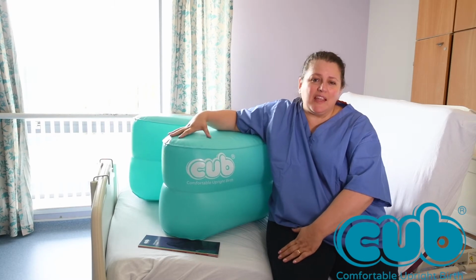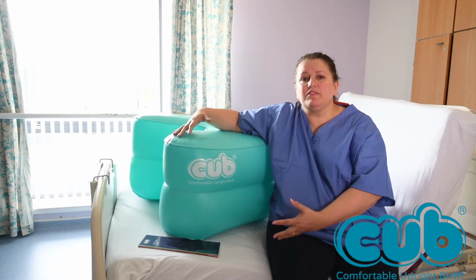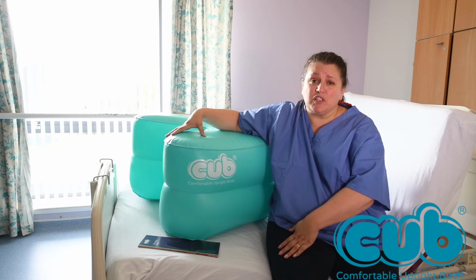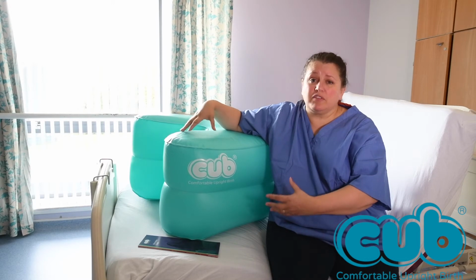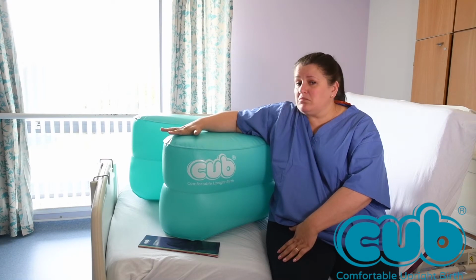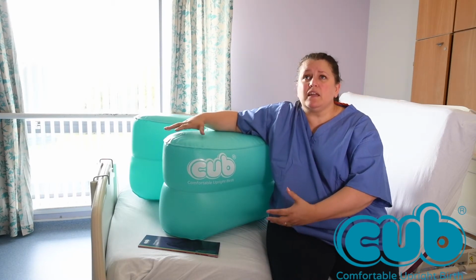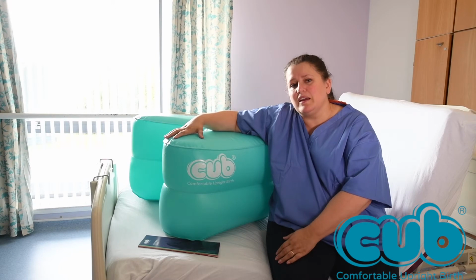The other things you would be thinking of as a healthcare professional, well, does it interfere with anything that we feel may be necessary? And by that I'm thinking of continuous monitoring. It's very easy to use with continuous monitoring, whether somebody's on the bed or using it on the floor or whatever position you're in. Examinations, you can easily perform vaginal examinations using this with the woman in different positions as well. Really it's about using your own judgment at the time about what it is you need to determine from anything that you're going to do.